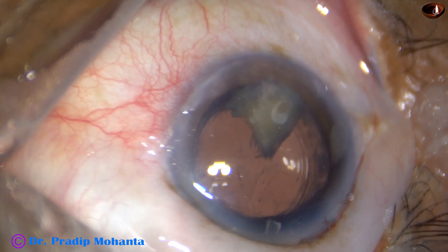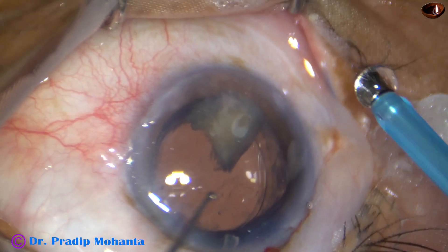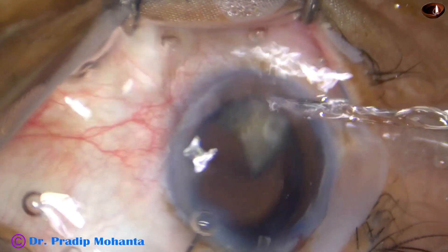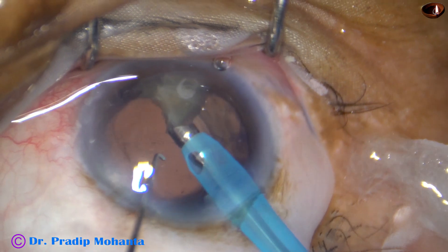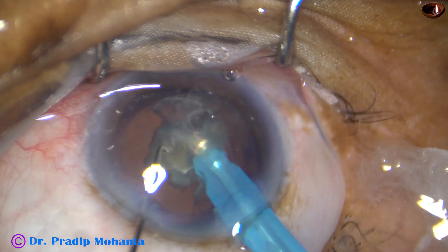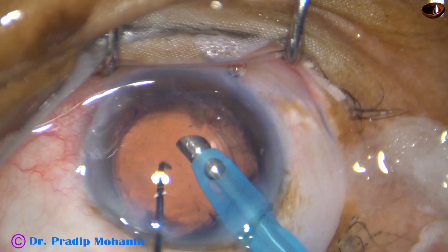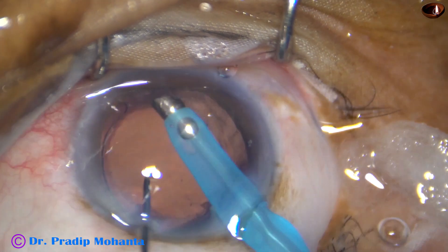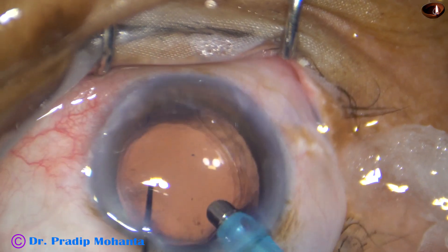The lens goes in the capsular bag and the nuclear piece is in the anterior chamber. Now I go again with the FACO handpiece and emulsify this nuclear piece. At this time I don't have any fear of causing a rent. With the handpiece itself I could remove a lot of cortex.